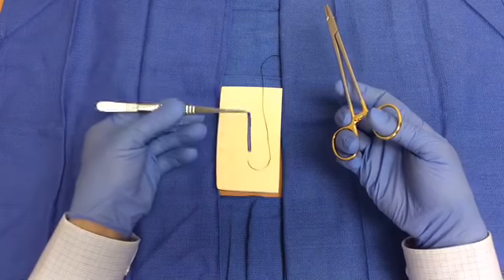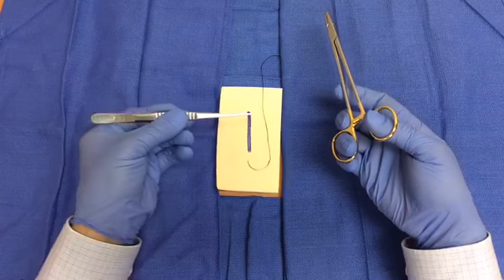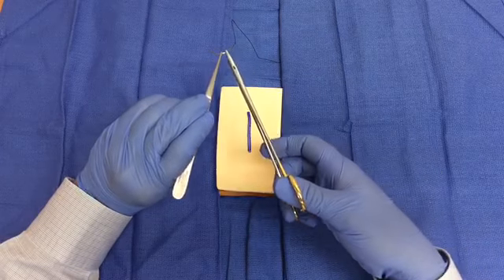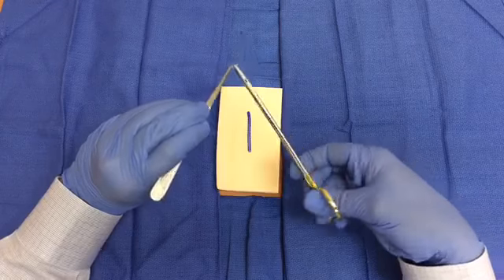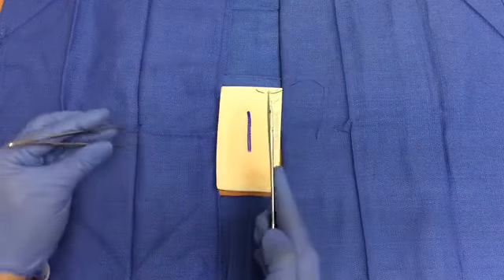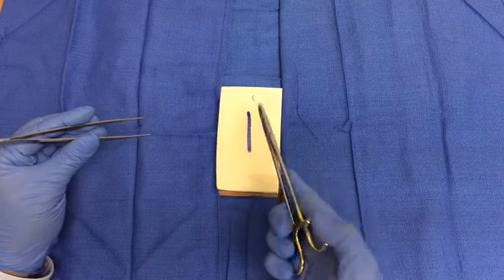Hold the forceps between your thumb and index and/or middle fingers. To avoid injury by handling the needle with your fingers, use the forceps to pick up your needle and load it in the needle driver so that it is perpendicular and at the tip of the instrument. The needle should be loaded at its midpoint to two-thirds back from the tip of the needle.